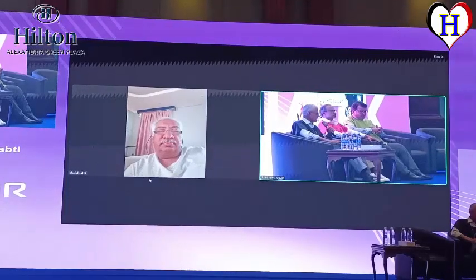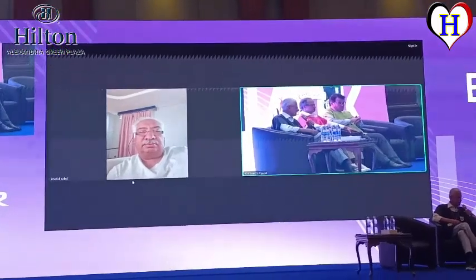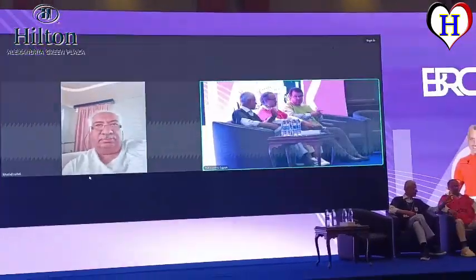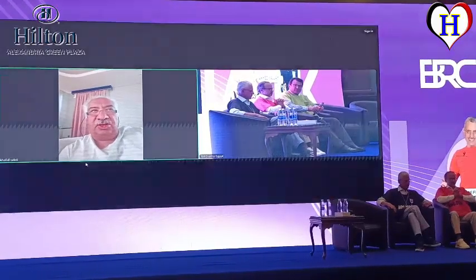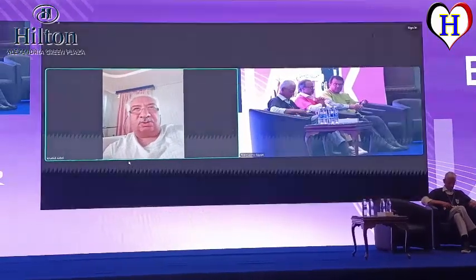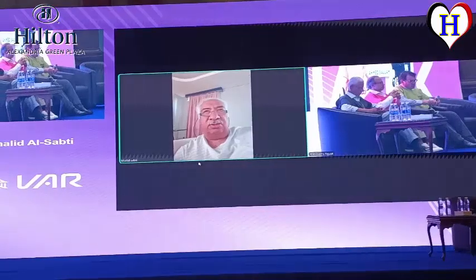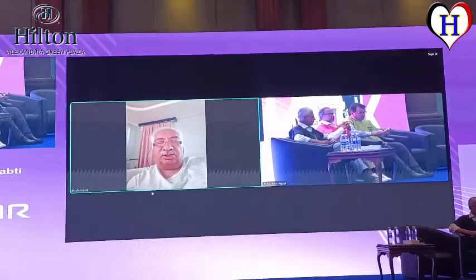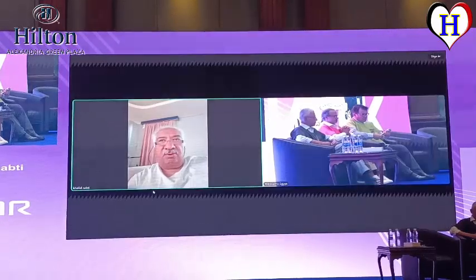But you managed this case properly. The only option was to remove the cannula and enlarge the incision, but definitely you have done the right thing to take it out from a small incision without jeopardizing the vitreous space. My concern with a lot of manipulation is that you can easily damage or fracture one of the blades, and guess what? It will go directly to the macula, you know, and that can cause serious problems. So obviously that went well, but as you said, the alternative was extending the sclerotomy and getting it out without breaking it.